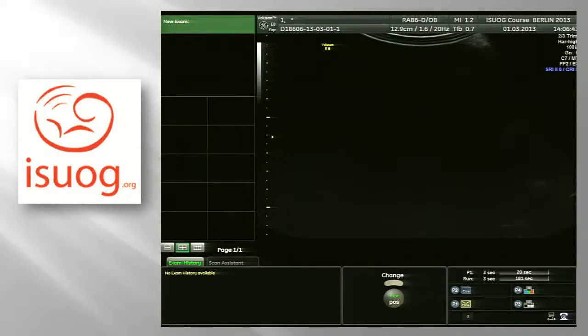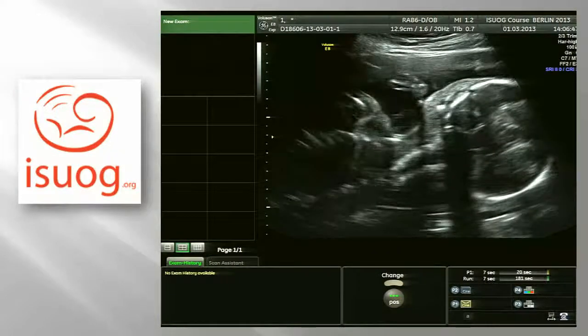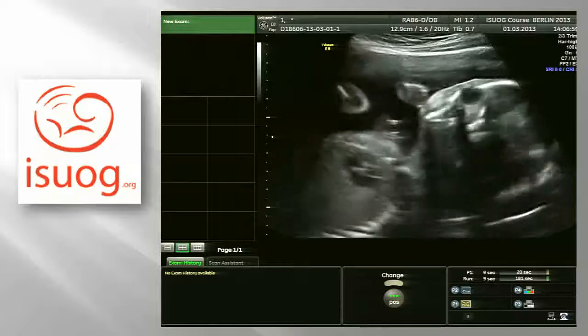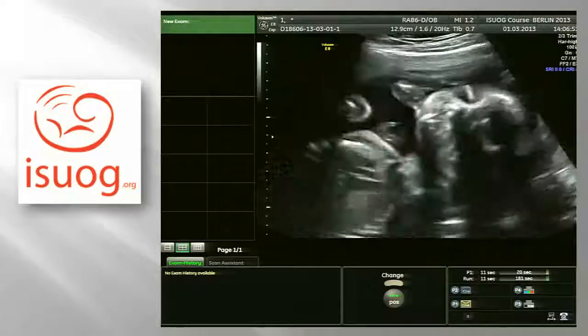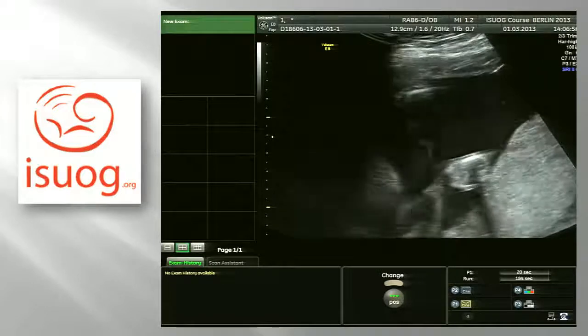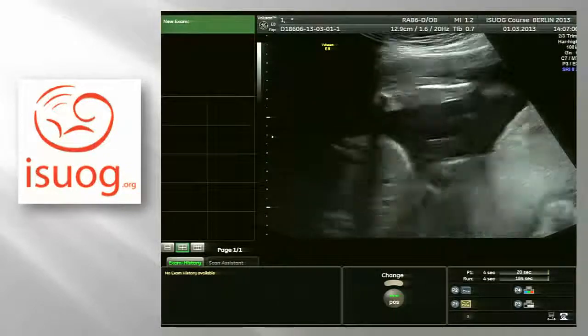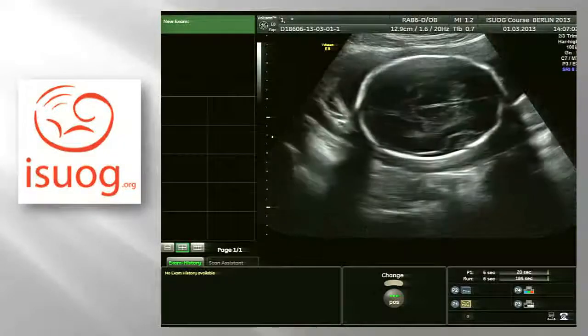It's okay. We can start? Yeah, I'm waiting for you. Okay. It's on the screen? It's on the screen, yes. Okay, so what I do, I start with abdominal probe, convex one.